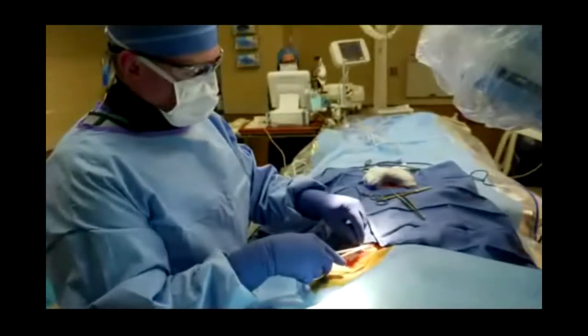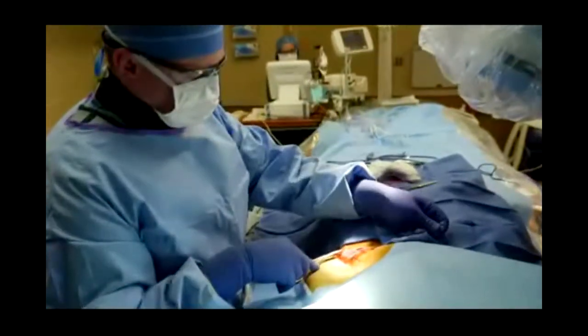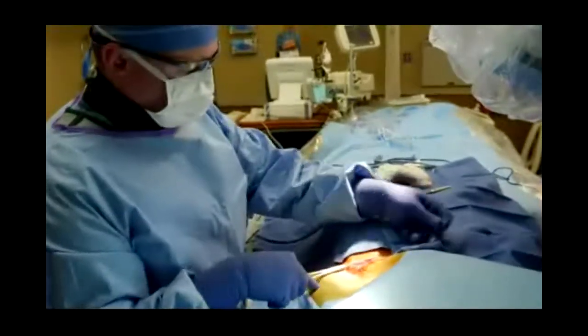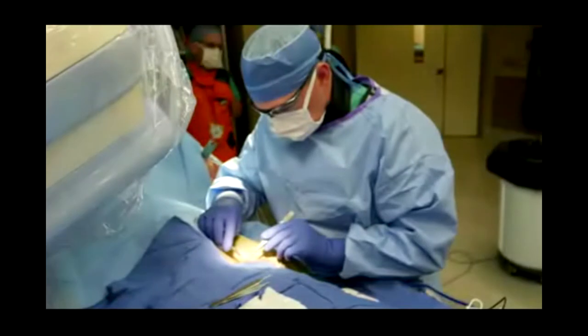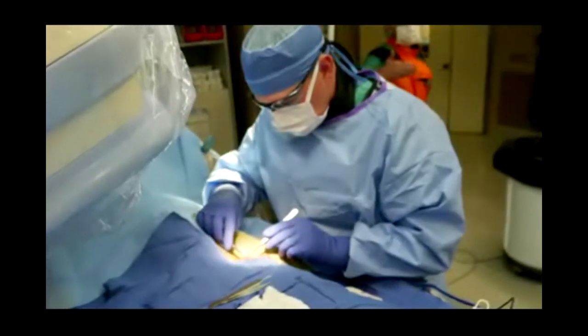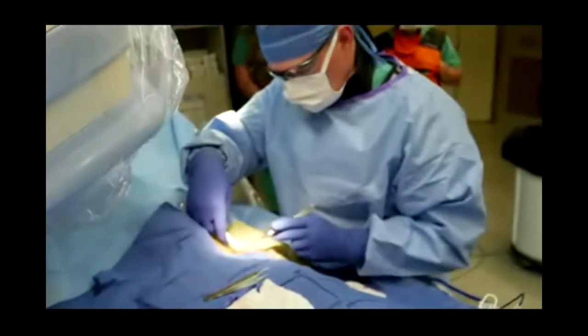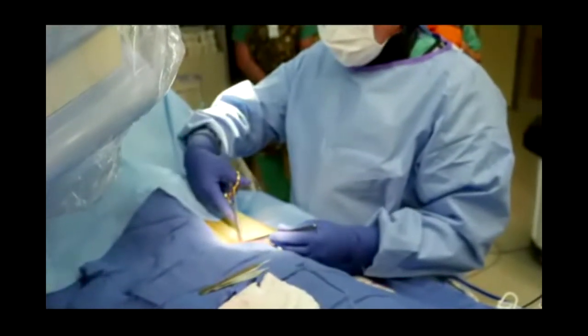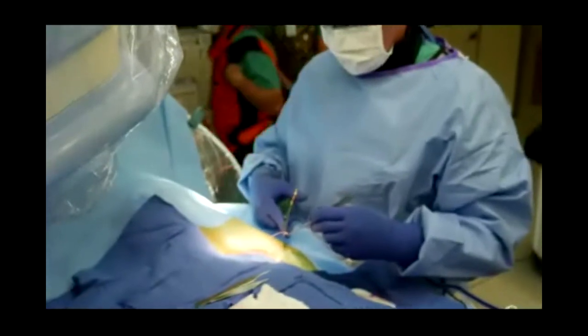There we are tying the suture down. This is following one of our initial layers of suture and will continue, like I said, for 3 to 4 layers total. And here's my assistant now doing the skin layer. This is the final beauty layer, which we also do very carefully to make sure that the scar resulting from our incision is absolutely minimal.